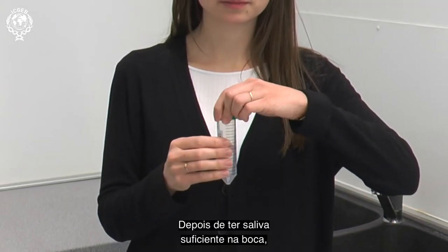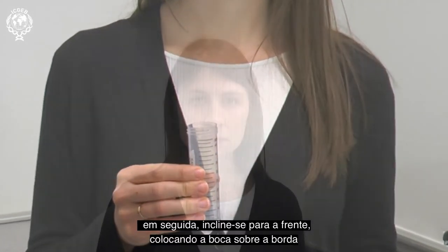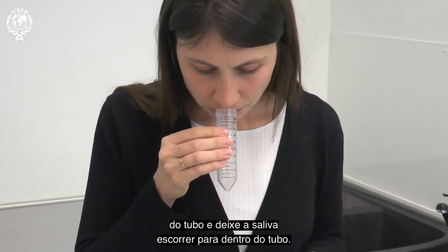Once you have enough saliva in your mouth, unscrew the cap off the collection tube, then lean forward, placing your mouth over the edge of the tube, and allow saliva to drool into the tube.